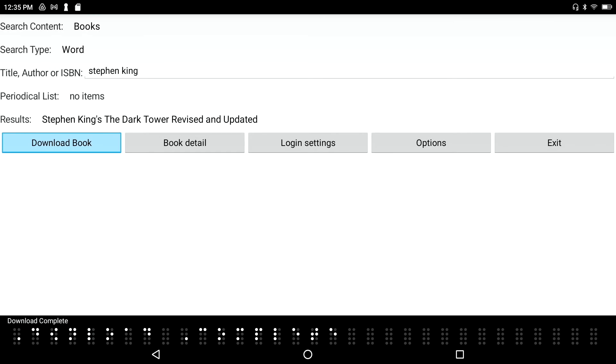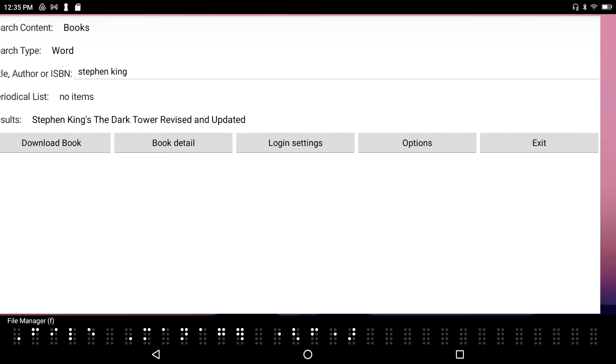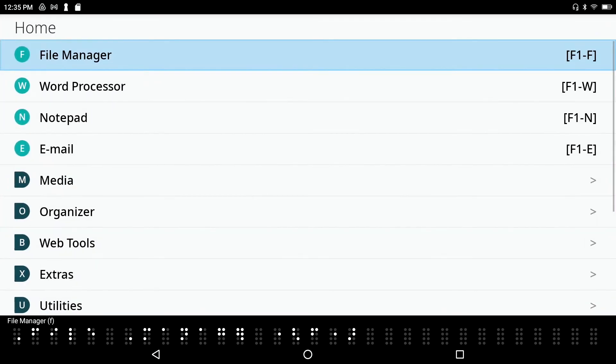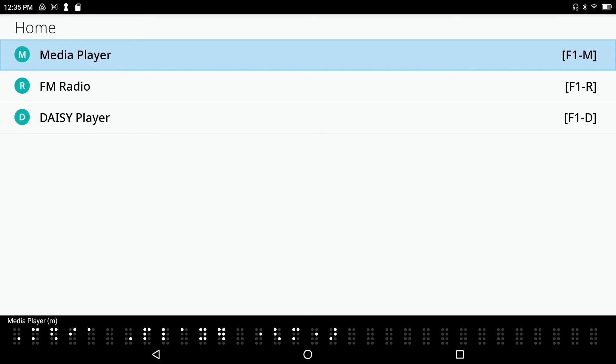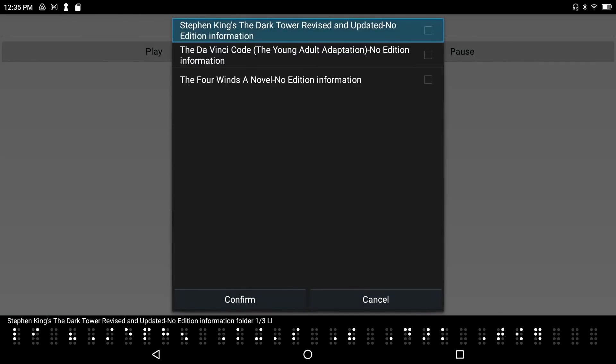The download's complete. I'm going to go back to my main menu, F1 file manager. The Daisy book reader is under the multimedia menu, so I'll press M for that from the main menu - media player. Letter D for the Daisy book reader.